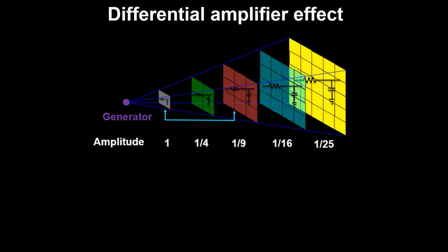I am representing the distance between the two electrodes by the aqua two arrow heads. If we were to increase the distance between the electrodes, as I am representing with the magenta two headed arrows, the amplitude of the wave coming into the amplifier would be less because the second electrode is more distant than in the prior example.